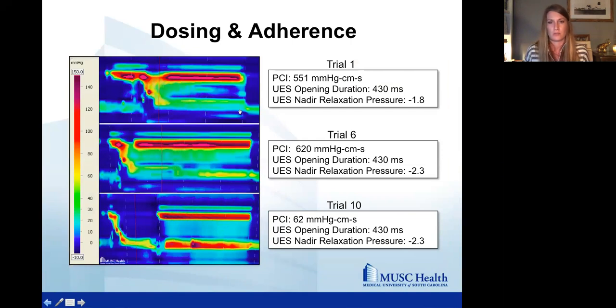She was very generous in providing her knowledge with me, but it got me thinking about how we use this for manometry. And so when we think about dosing and adherence, we really have the PT and OT literature to rely on, but we know that limb versus cranial nerves act very differently. So we can only really surmise from that literature what's best for our patients.